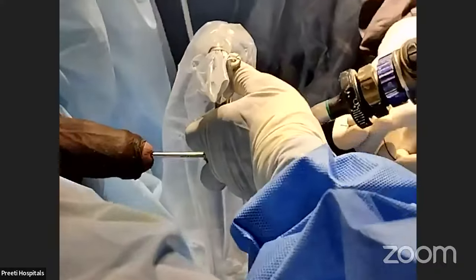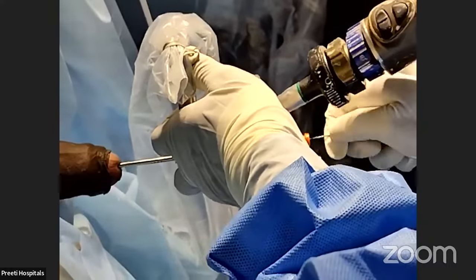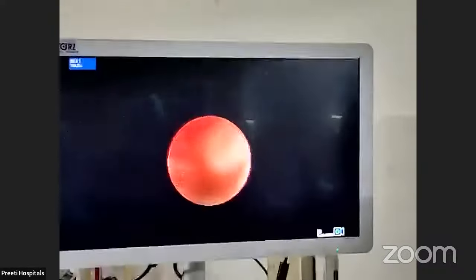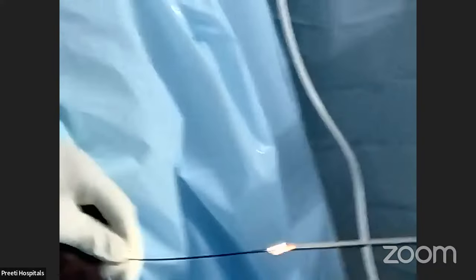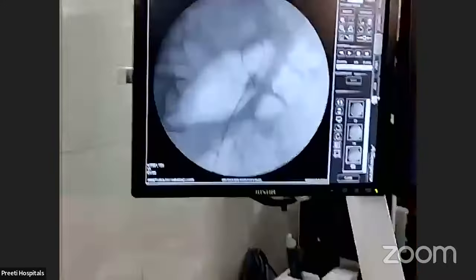These are the things we have to learn. So any new procedure will have intricacies. The ultimate idea is don't damage the ureter. See, after experience also, I thought because it is stented, I can pass. I am not able to pass. So I will see again. This penis is slightly smaller, so we have to look into that aspect. Now, can we do the sheath again? Yeah, we will take a new sheath because these are not reusable. You can see the stone there. You can see the guide wire also.